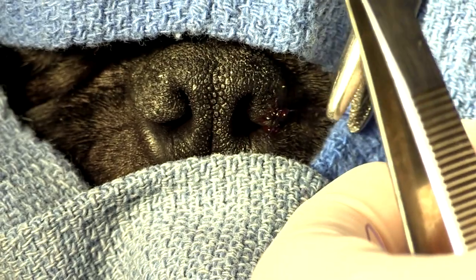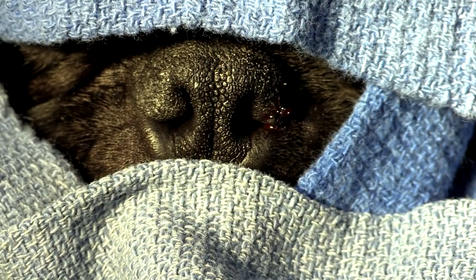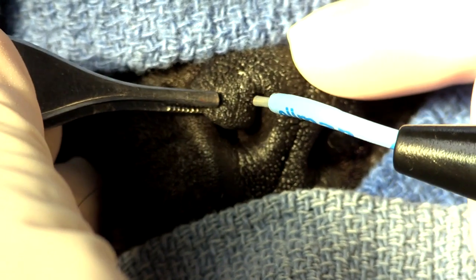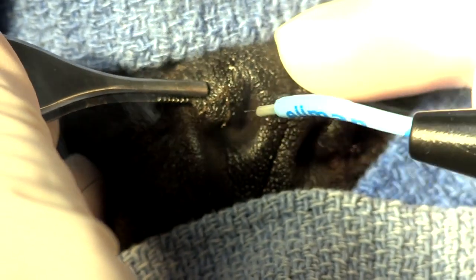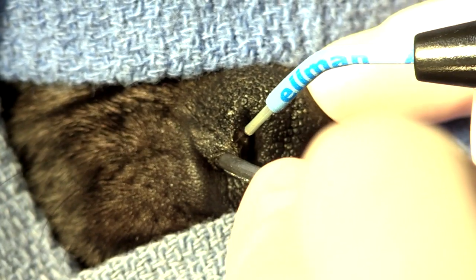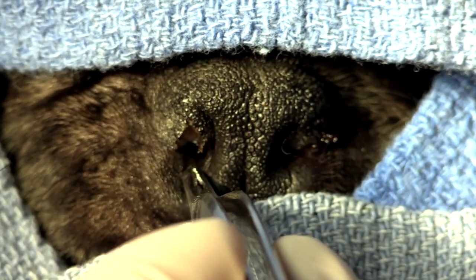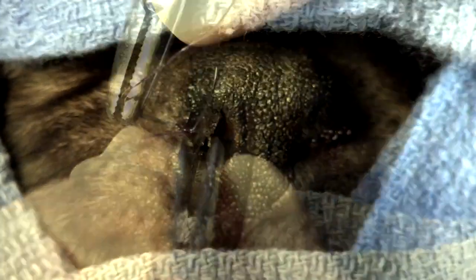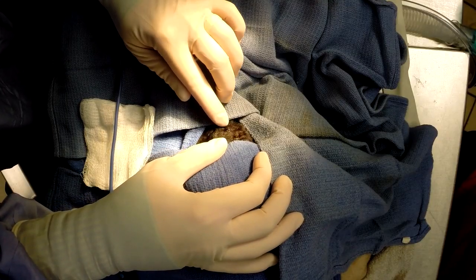Now depending on how big the nose is and how much you have to take, you may have to put a couple of stitches in, but this one I think I'm just going to be able to get away with just one. Now we just go to the other side — the other side is not quite as bad — so on this we're just going to do the same wedge. There's my little wedge, very nice. So now we've got two nice openings, and he's going to be able to breathe when he wakes up.